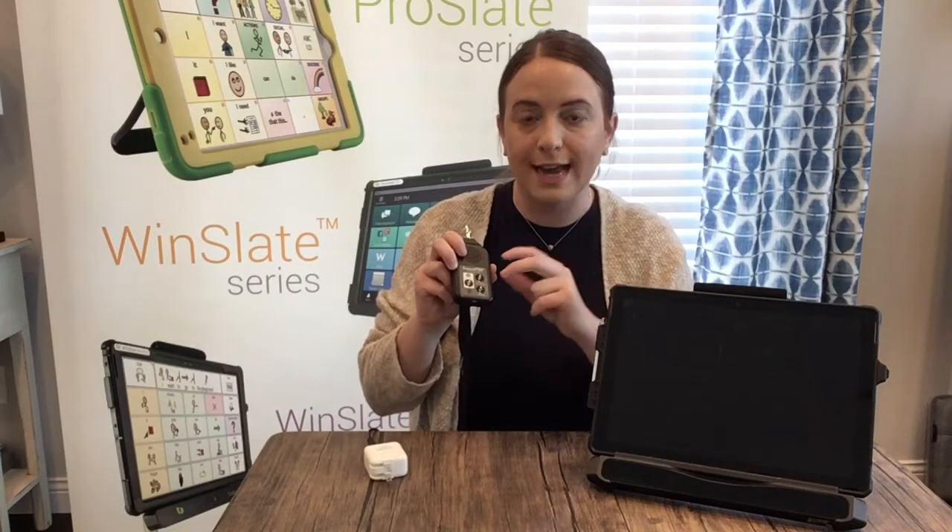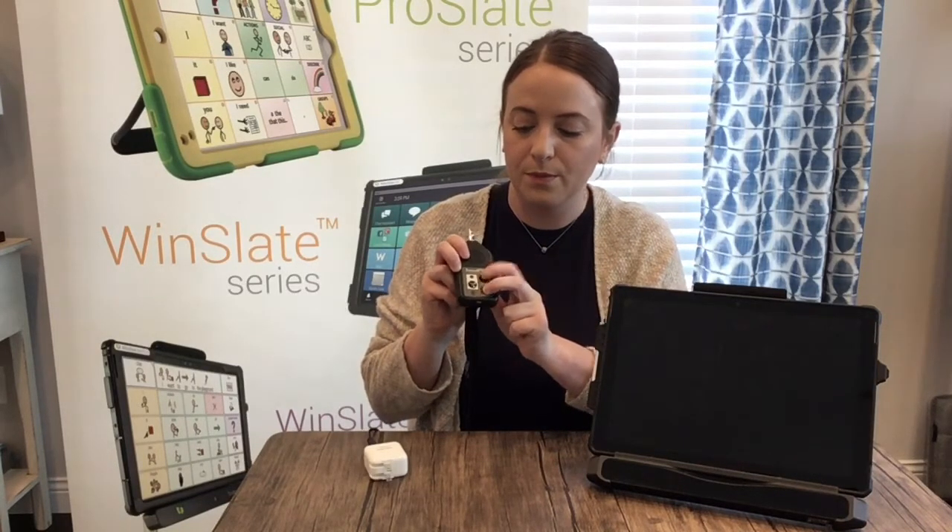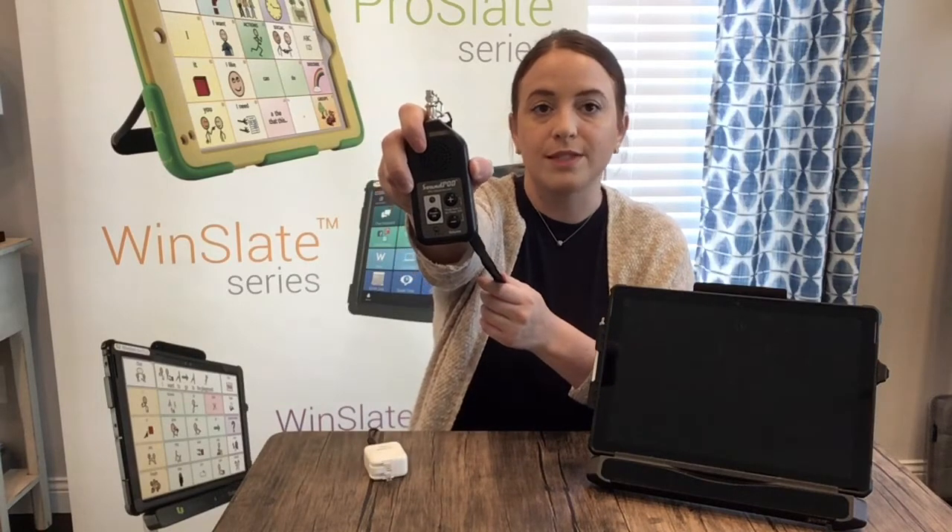To turn it off, you're going to find the plus and minus button. Hold those down at the same exact time and the green light will go away. No more green light — the sound pod is off.